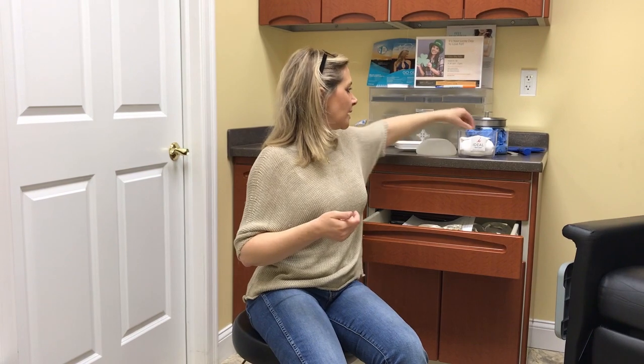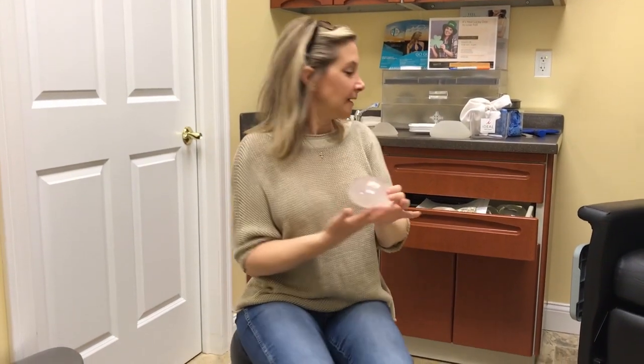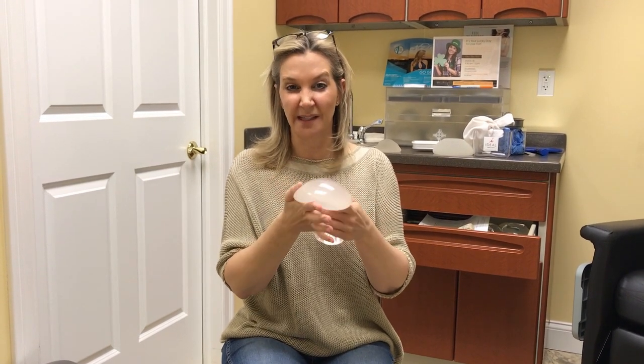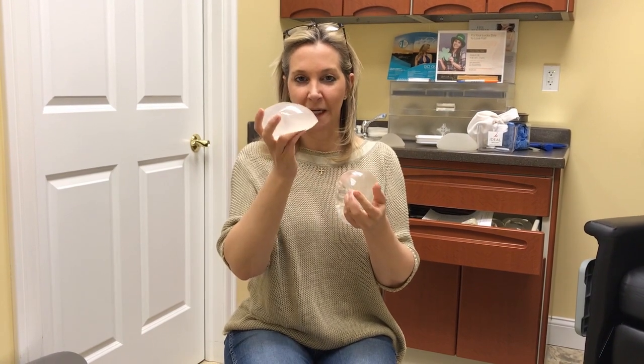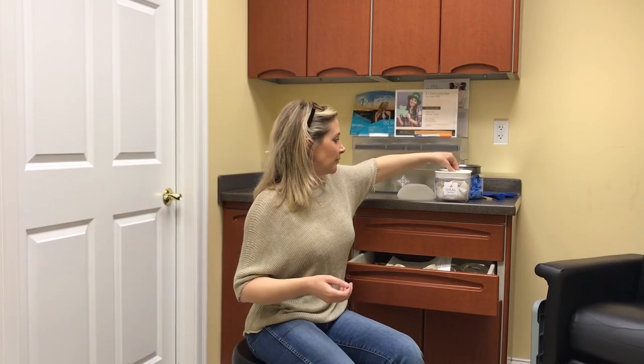The newer saline implant is the ideal implant, which I have here. It doesn't feel nearly as good as this gel implant. But the difference between this and a bag of fluid that's the saline implant is there's layers of silicone layered, interspersed in this implant, so it makes it feel a little more gentle, a little more natural. So the question then remains, why would anybody use a saline implant over a gel implant?